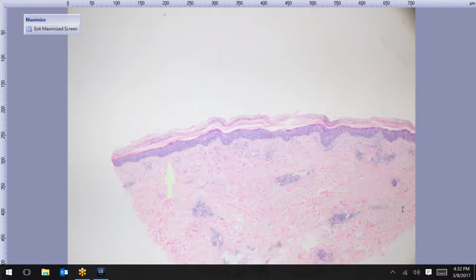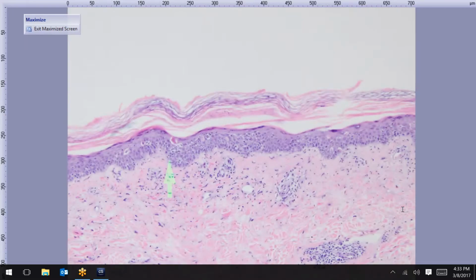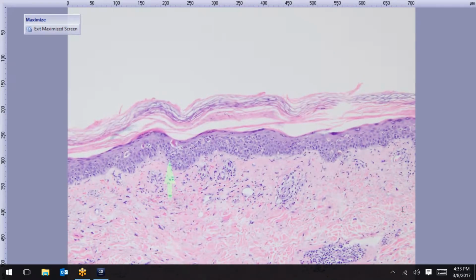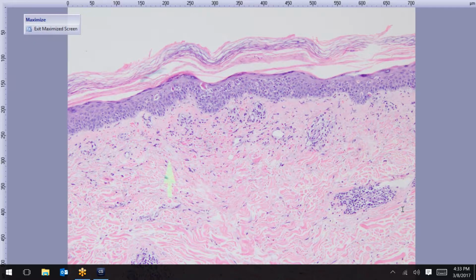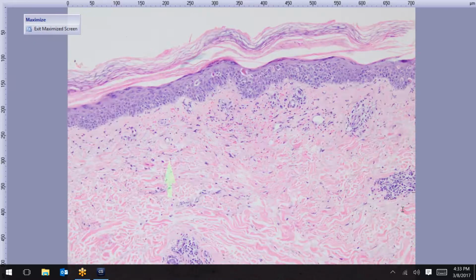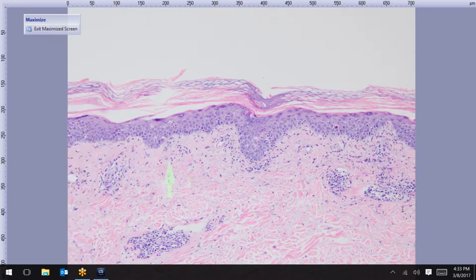All right, we'll go to another inflammatory case. Going to a higher power. I think the lower power is a little tough to appreciate on that. Anybody want to type in or say the category or type of inflammation?